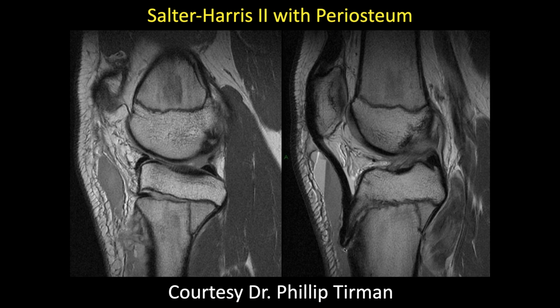Yeah, right. So just remember that this is an important finding that needs to be described in the report, but the treatment's significance is still controversial. Yeah, but the radiologist has nothing to worry about. You call it, you don't treat it. Right, right.